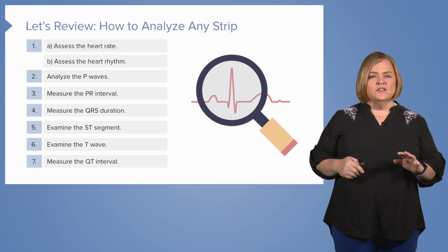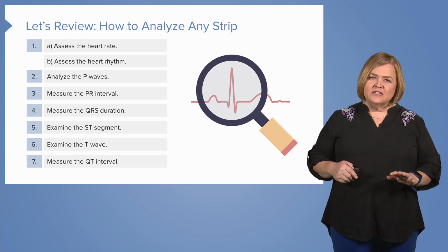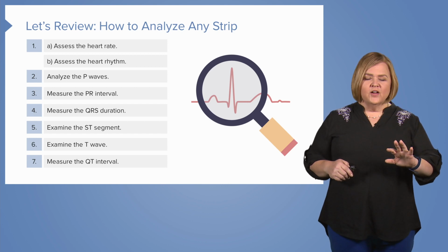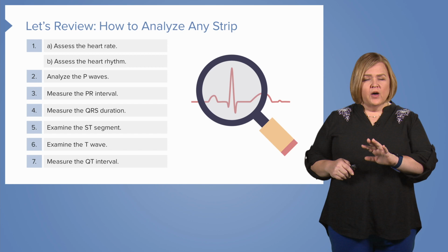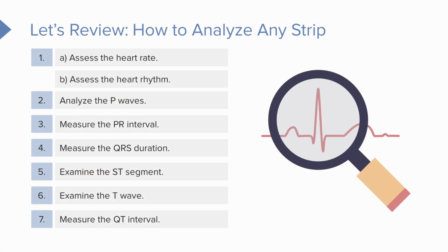We've got the 7 steps of how to analyze any strip. We're not going to go into detail on those here because we do in our other videos. But there they are. If this is one of your first videos to watch with us, you want to pause the video, walk through each one of the 7 steps, and make sure you know what that means and how you would do that. Otherwise, the rest of this video may be a little bit of a struggle for you.